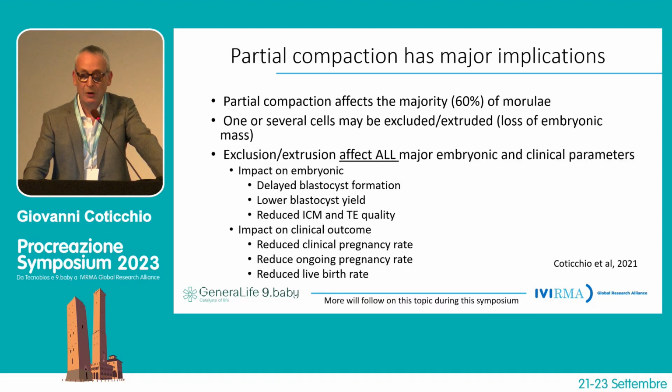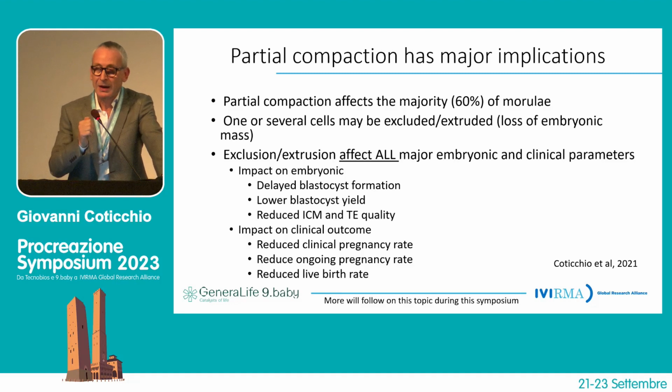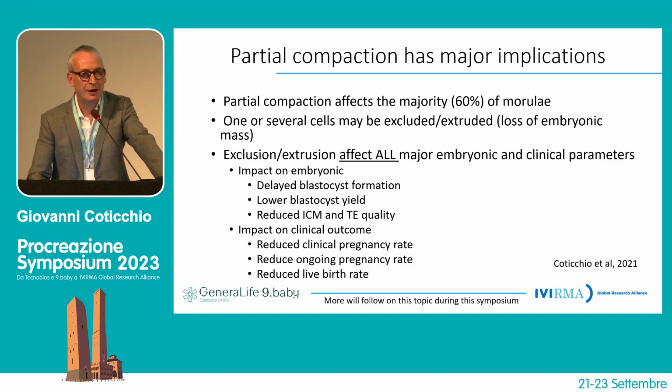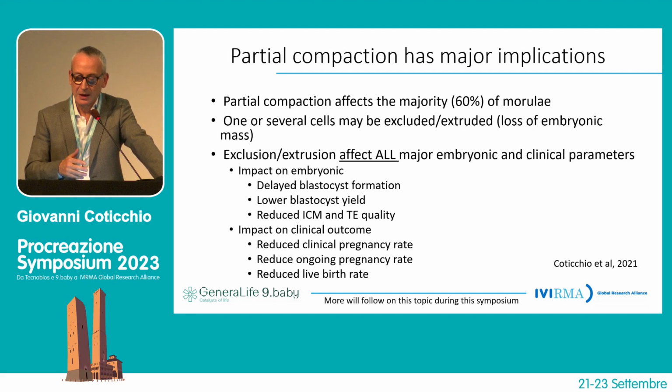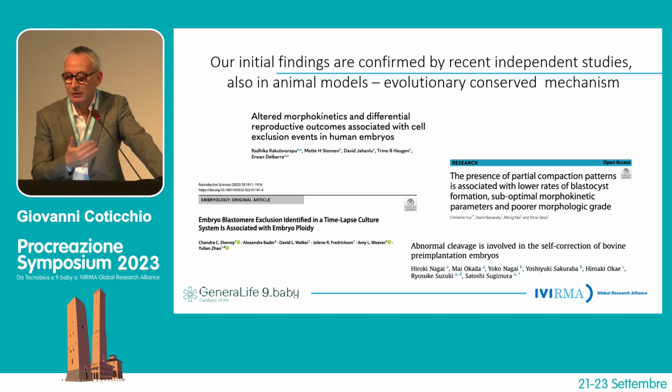Now, we know from recent work that both patterns of failed compaction affect, in fact, the majority of morulae. And these can affect one or more cells, with obvious implications in terms of size of the defect. And whatever the case, exclusion and extrusion affect all the major clinical and laboratory parameters on which basis we measure our performance. So it is an important manifestation of embryo quality that would have gone unnoticed without time-lapse.